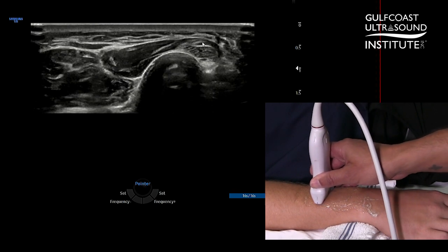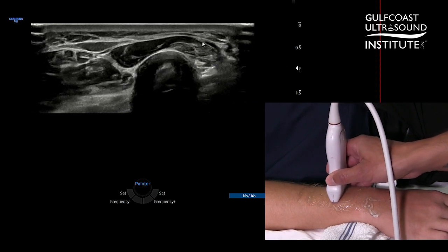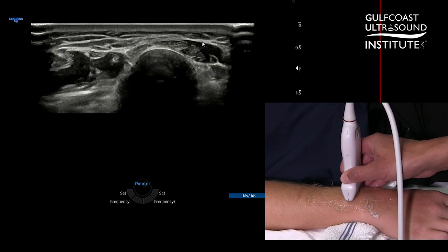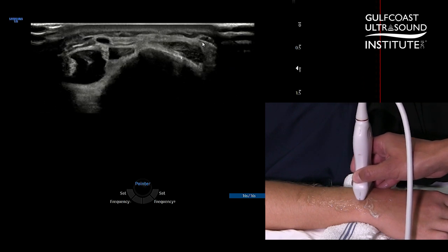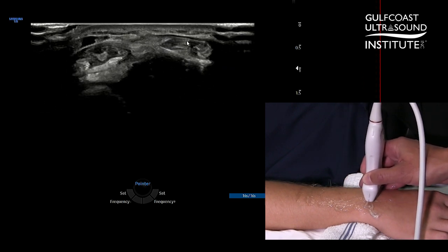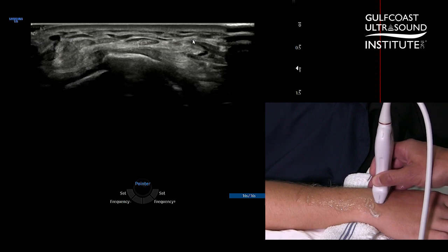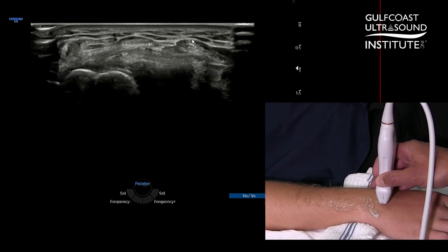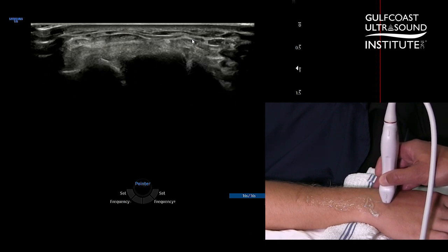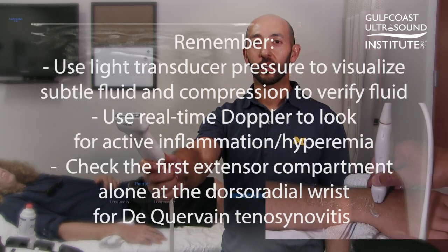So again, compartment one over two, and then compartment three over two. Both intersection syndromes — proximal being more common and distal being less common. Well, that's your hot tip of the day. Now you give it a try.